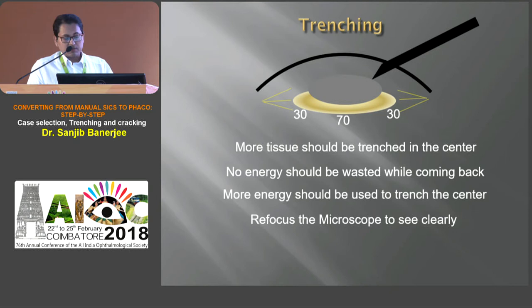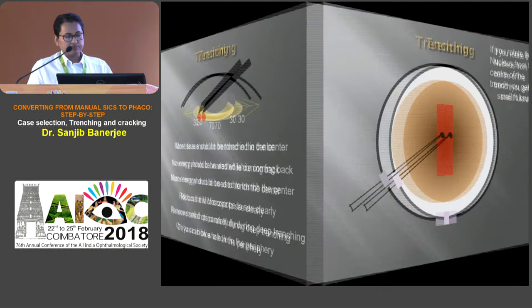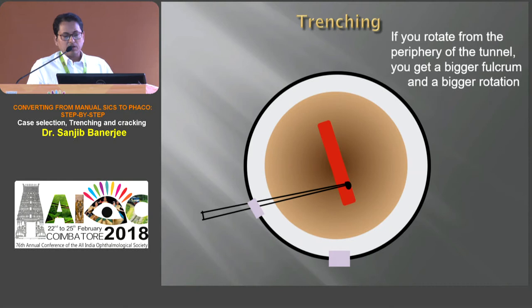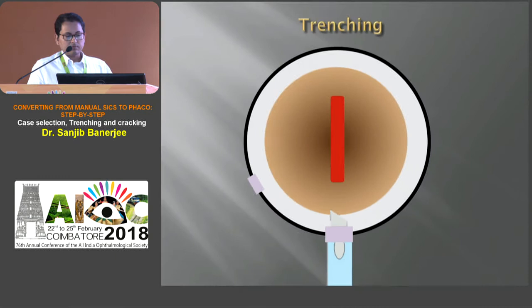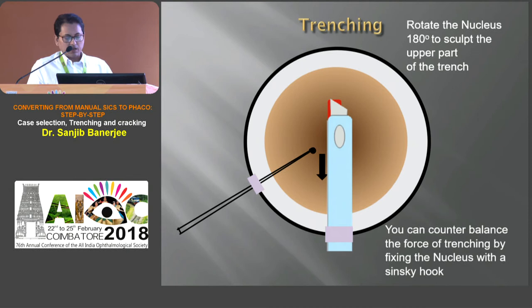Remove small chips during deep trenching; otherwise we may blow a hole in the periphery. While rotating the nucleus — if we rotate from the center of the trench we get a short fulcrum making rotation difficult, but if we push from the periphery of the tunnel we get a bigger fulcrum and better rotation. When one side of the nucleus is trenched and the nucleus is rotated 180 degrees to trench the other side, we can counterbalance the force of trenching by fixing the nucleus with a Sinsky hook. For cracking, place the two instruments at the deeper part of the trench and apply equal force on either instrument.